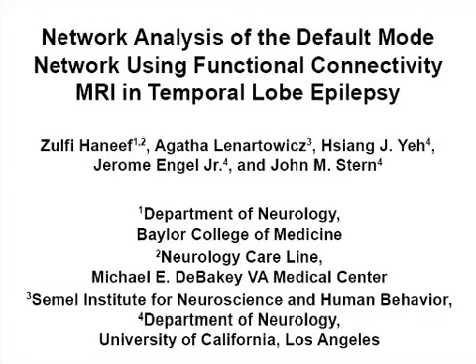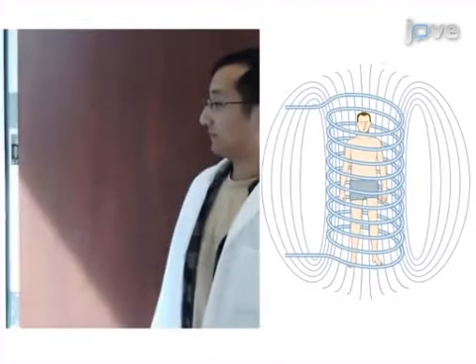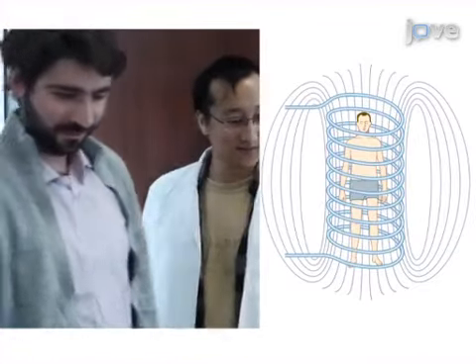The overall goal of the following experiment is to obtain statistical maps comparing the difference of resting state fMRI scans between healthy controls and patients with epilepsy. This is achieved by obtaining fMRI data in subjects with temporal lobe epilepsy as well as healthy control subjects.